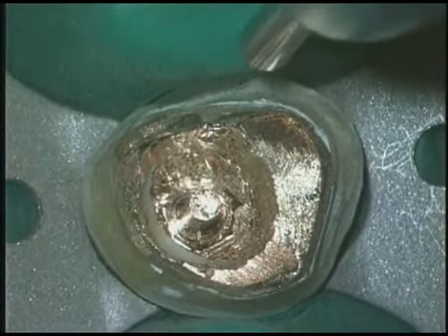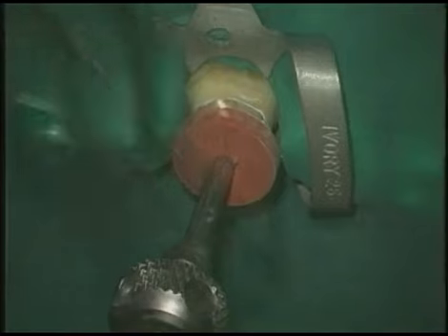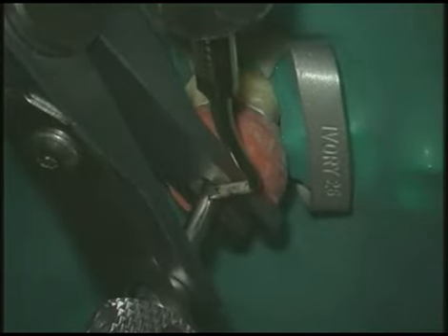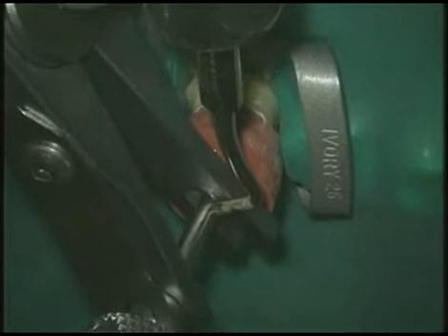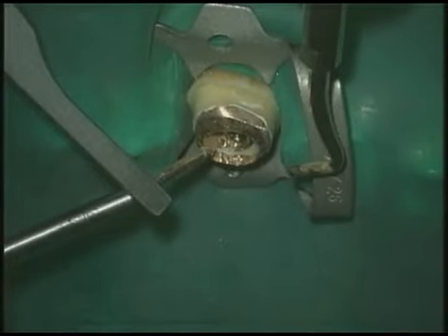Very easily we can tap these in the usual manner, using protective bumpers to cushion the top of the tooth from the removal loads. And sometimes multiple bumpers are employed to protect adjacent teeth or to properly get the plier in position in posterior roots. Ultrasonics is commonly used, as you've seen, with the post-removal system because it enhances the removal. Once the palatal post is removed, we're going to have a great shot in through the core looking down into the palatal root.